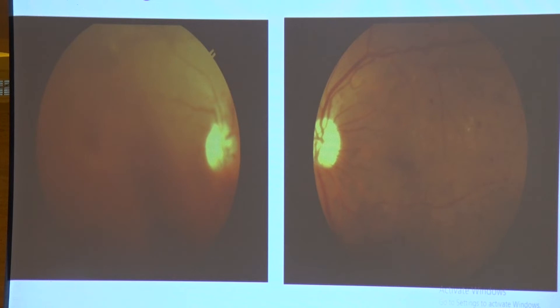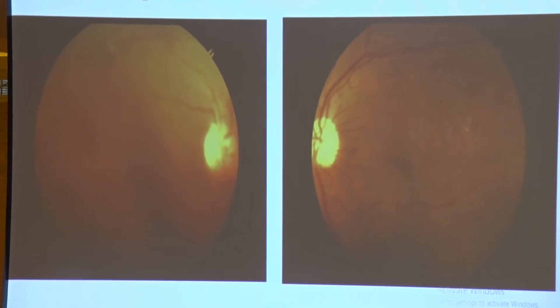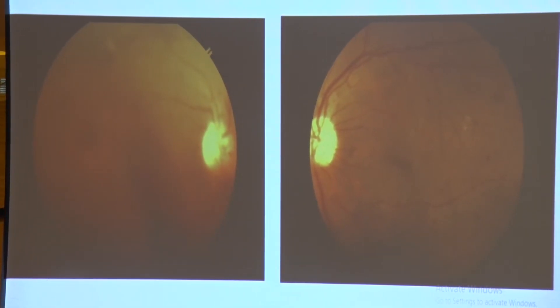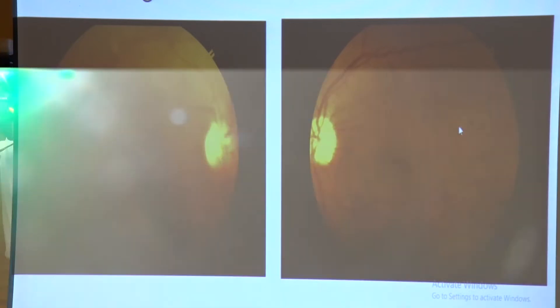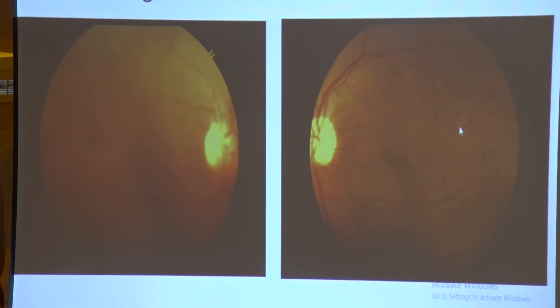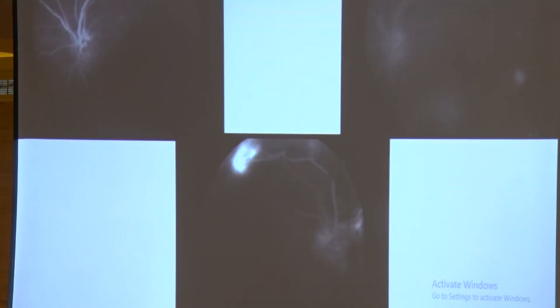Now I will show cases where even with wide-angle OCTA, normal angiography done with not-so-expensive machines still allows diagnosis of most pathologies. I'll show two sets of pictures — one from a good Indian upgraded angiography machine. If you see the fundus photograph of the right eye, there is media opacity, probably vitreous hemorrhage. The left eye shows microaneurysms and hard exudates. The quality of photographs may differ, but I don't rate these images as inferior.